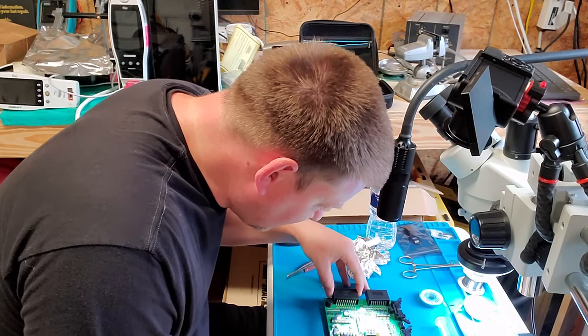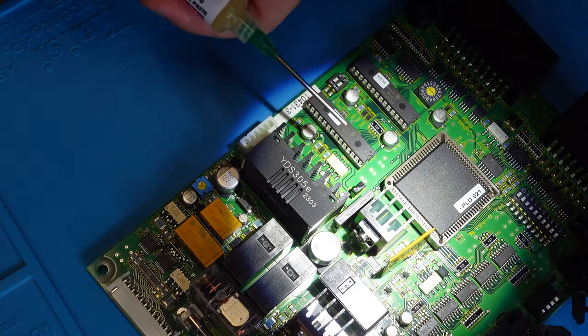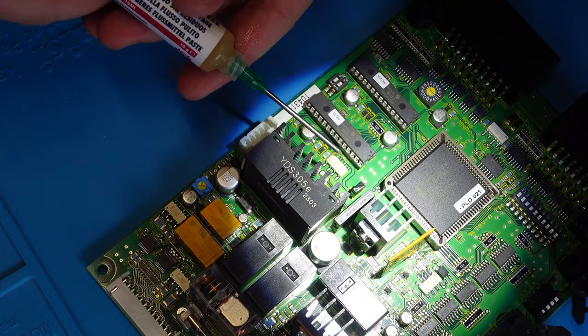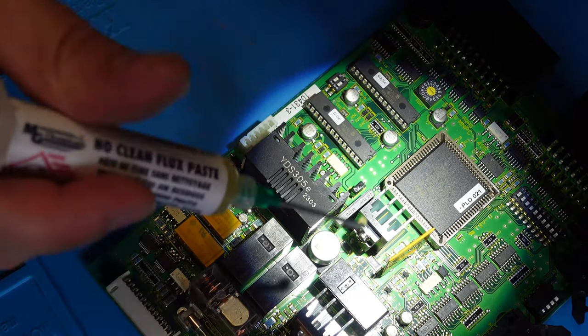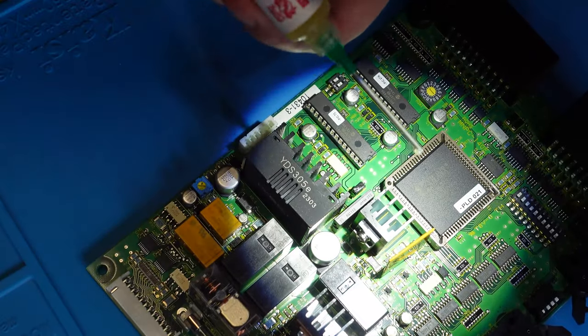All right, I'm just checking the sites right now to make sure everything is clear. I'm going to go ahead and put down some flux, just a spot here. A spot right here. Put down some flux over the pins.